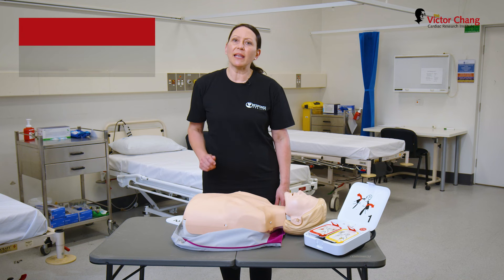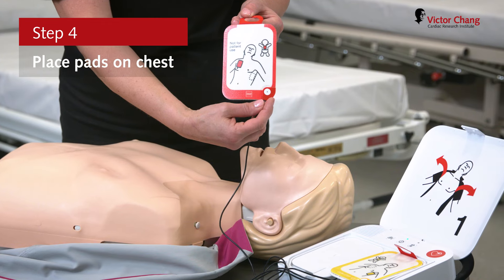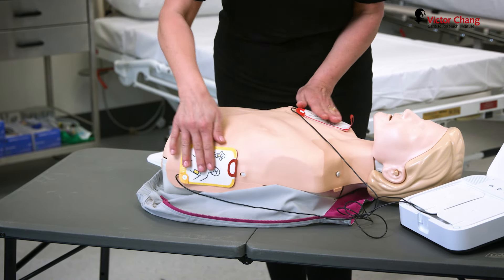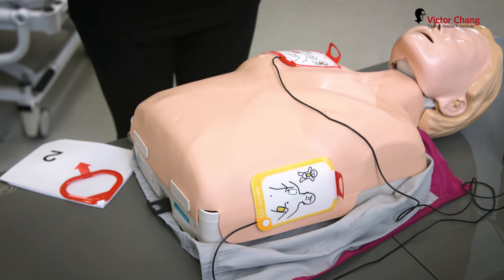Now it's time to place the pads onto the person's bare chest. Apply pads to bare skin exactly as shown in the pictures, and press the pads firmly. At this point, the defibrillator will start analysing the person's heart rhythm.